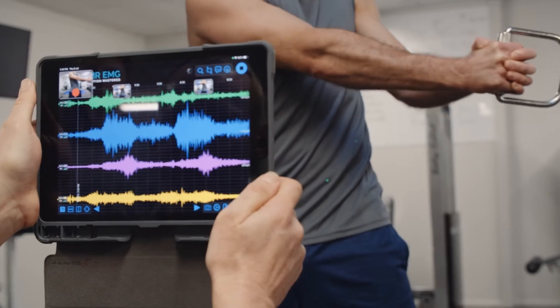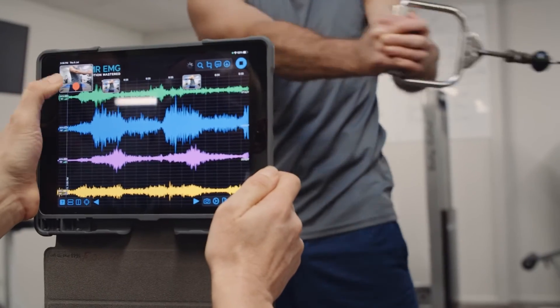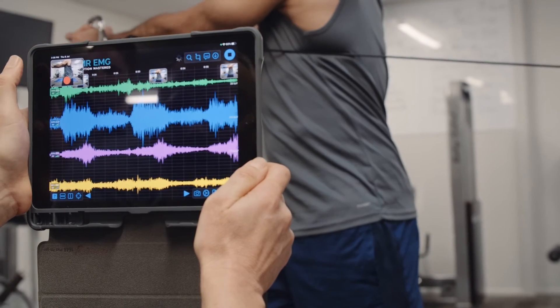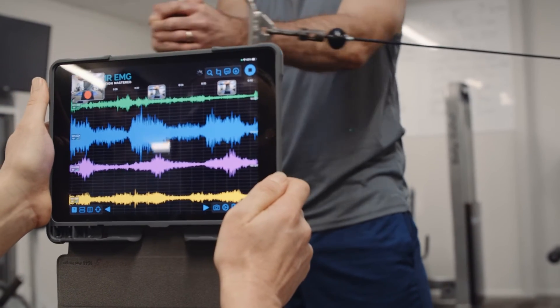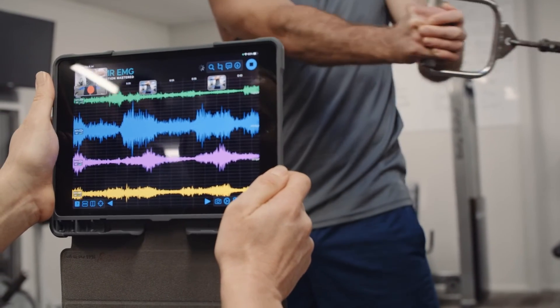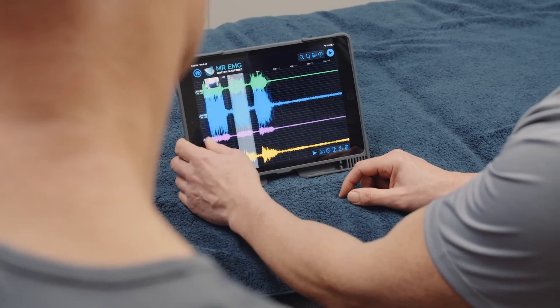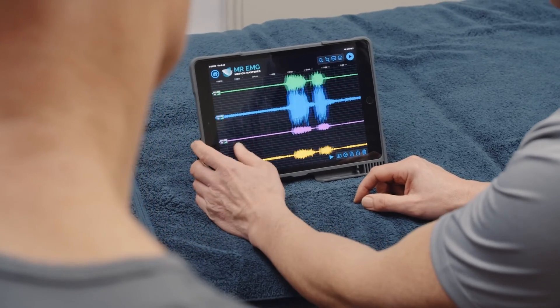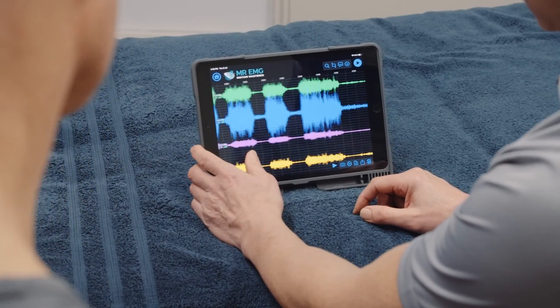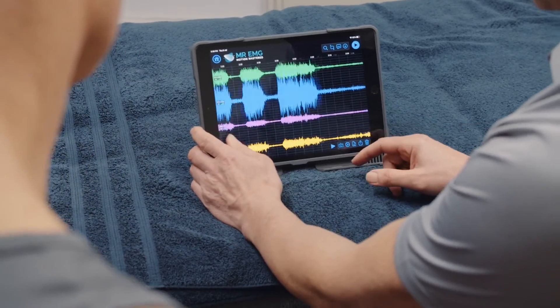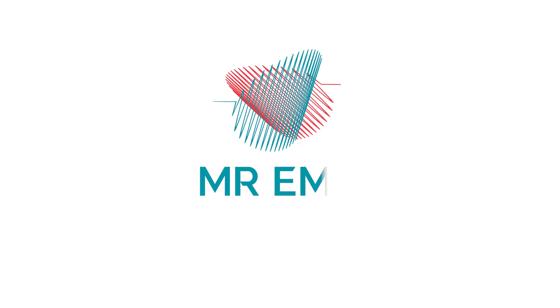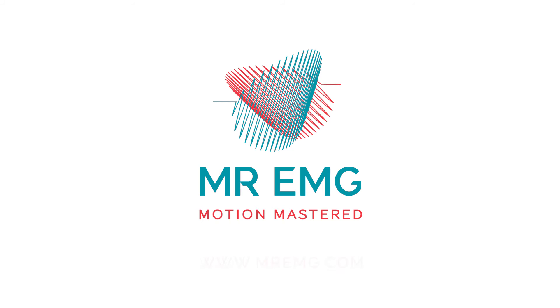The exercises you test are entirely up to you, the clinician, and what you would deem most appropriate for each subject based on their symptoms. To conclude the assessment, we recommend you sit down with your subject and analyse their data, identifying any muscle hyperactivity or inactivity during movements you feel is related to their symptoms. We hope you enjoy using Mr. EMG.